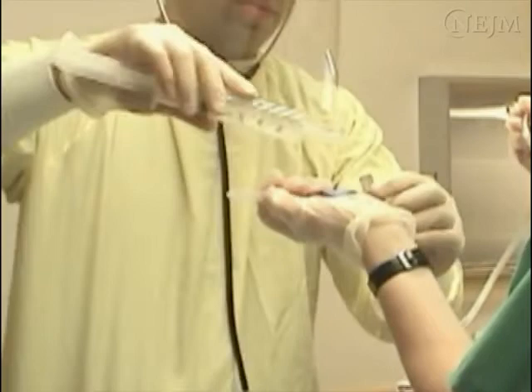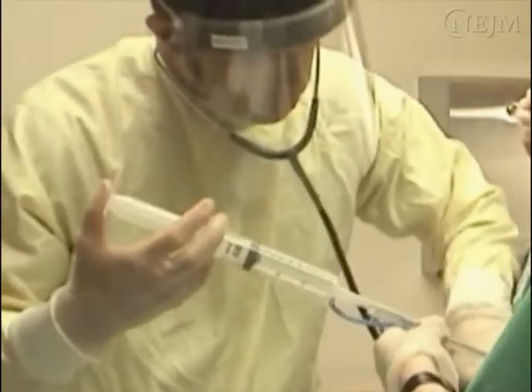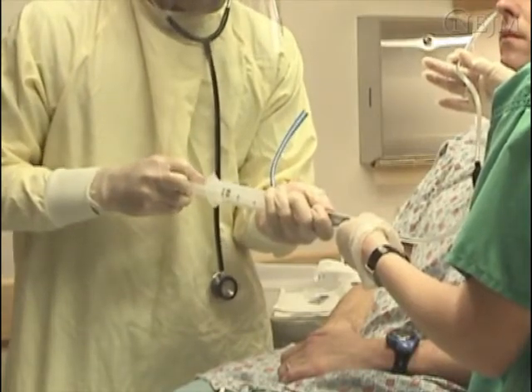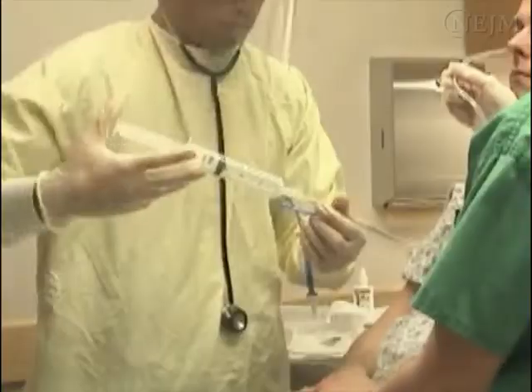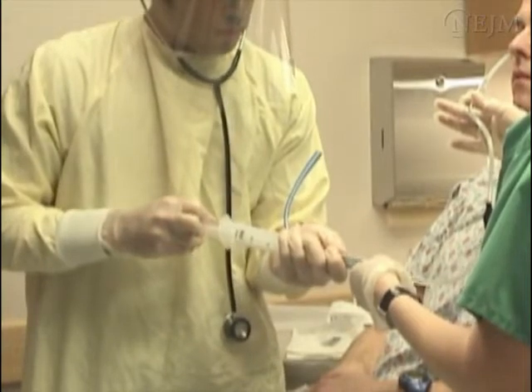Attach the catheter tip syringe to the main port of the NG tube and insufflate 30 cc of air while auscultating over the epigastrium. A gurgling noise should be clearly audible. Using the same syringe, aspirate the NG tube and ensure that it fills with gastric contents. It should be noted that auscultation and aspiration may occasionally provide false positive results.